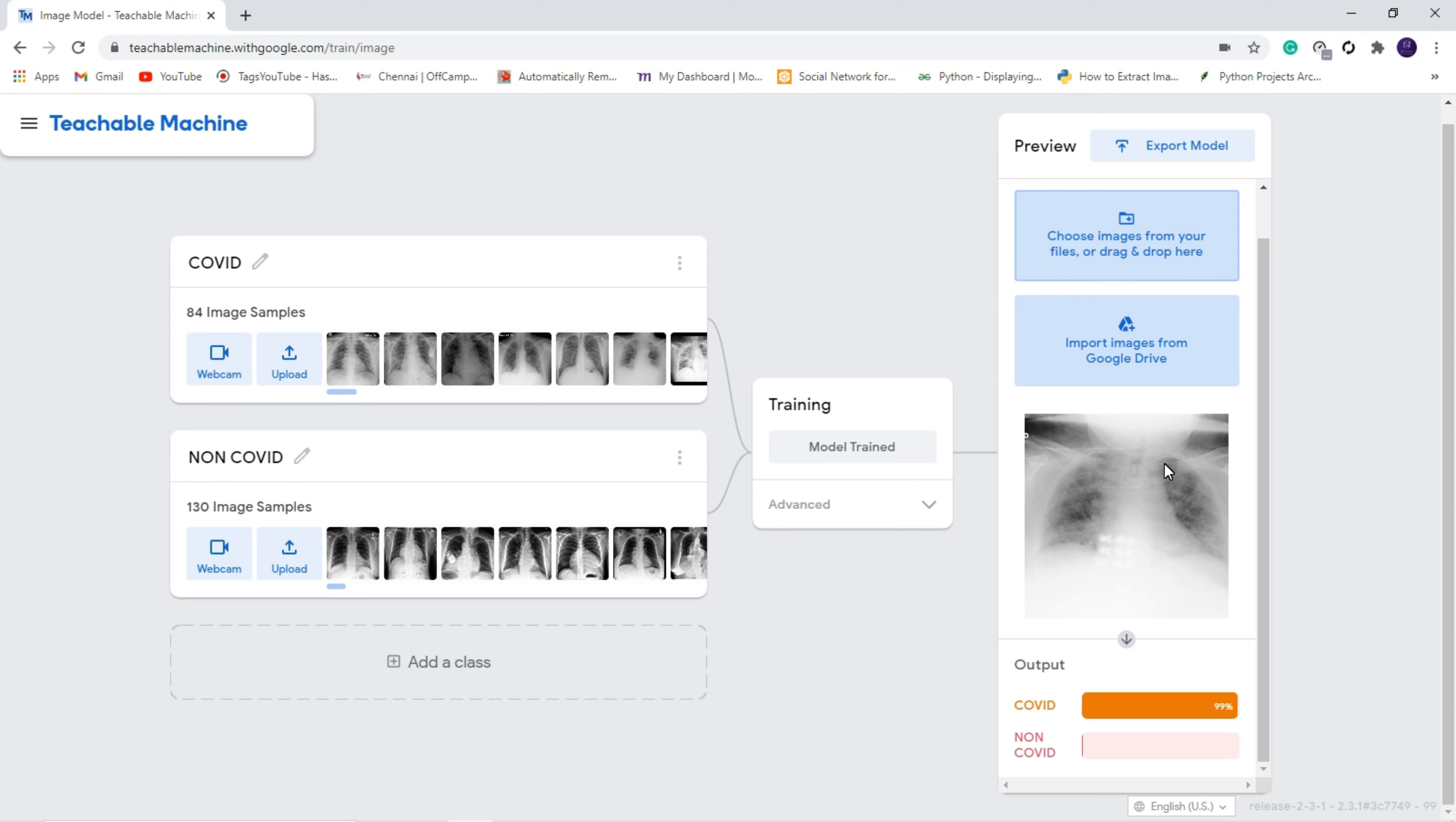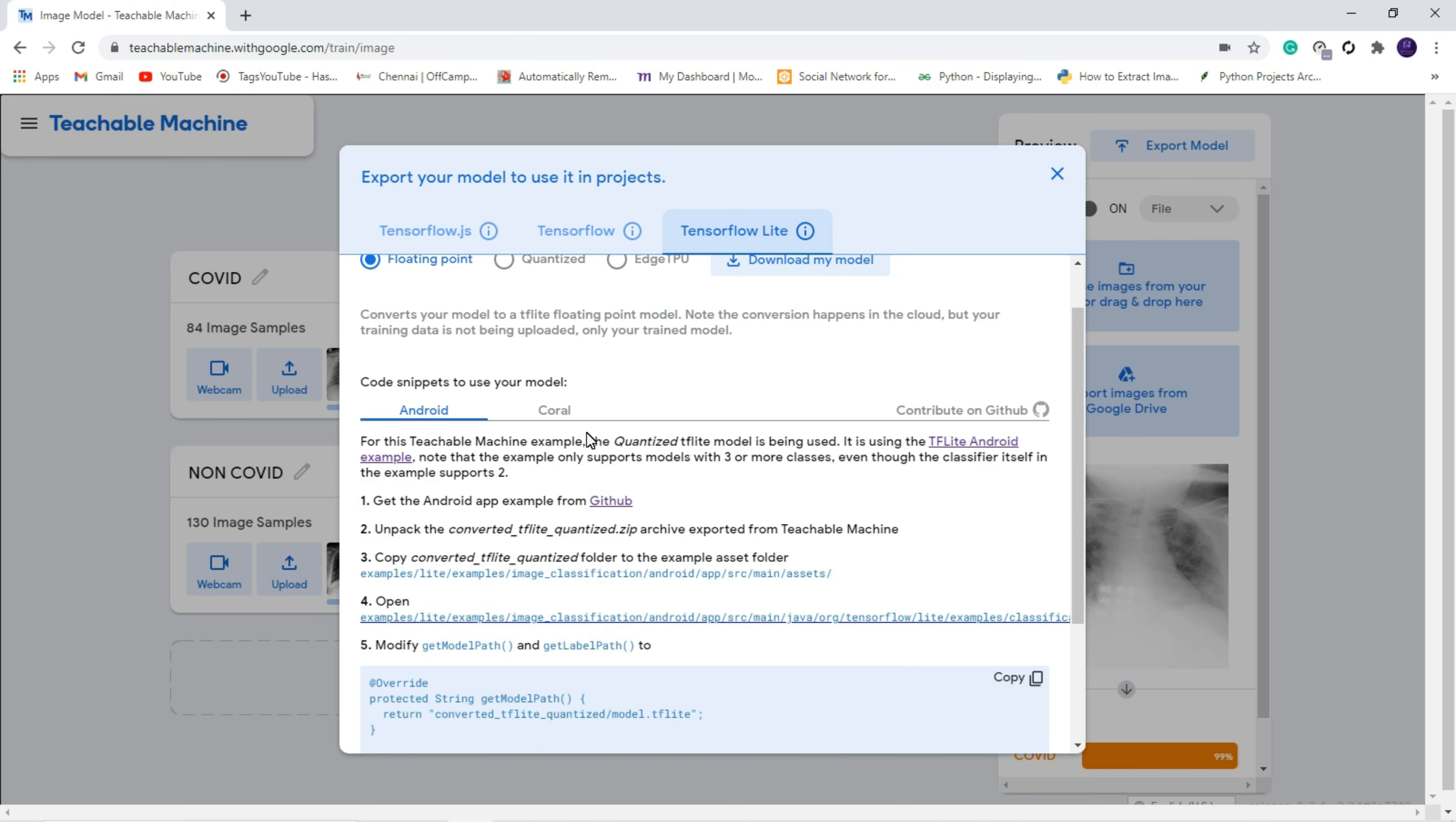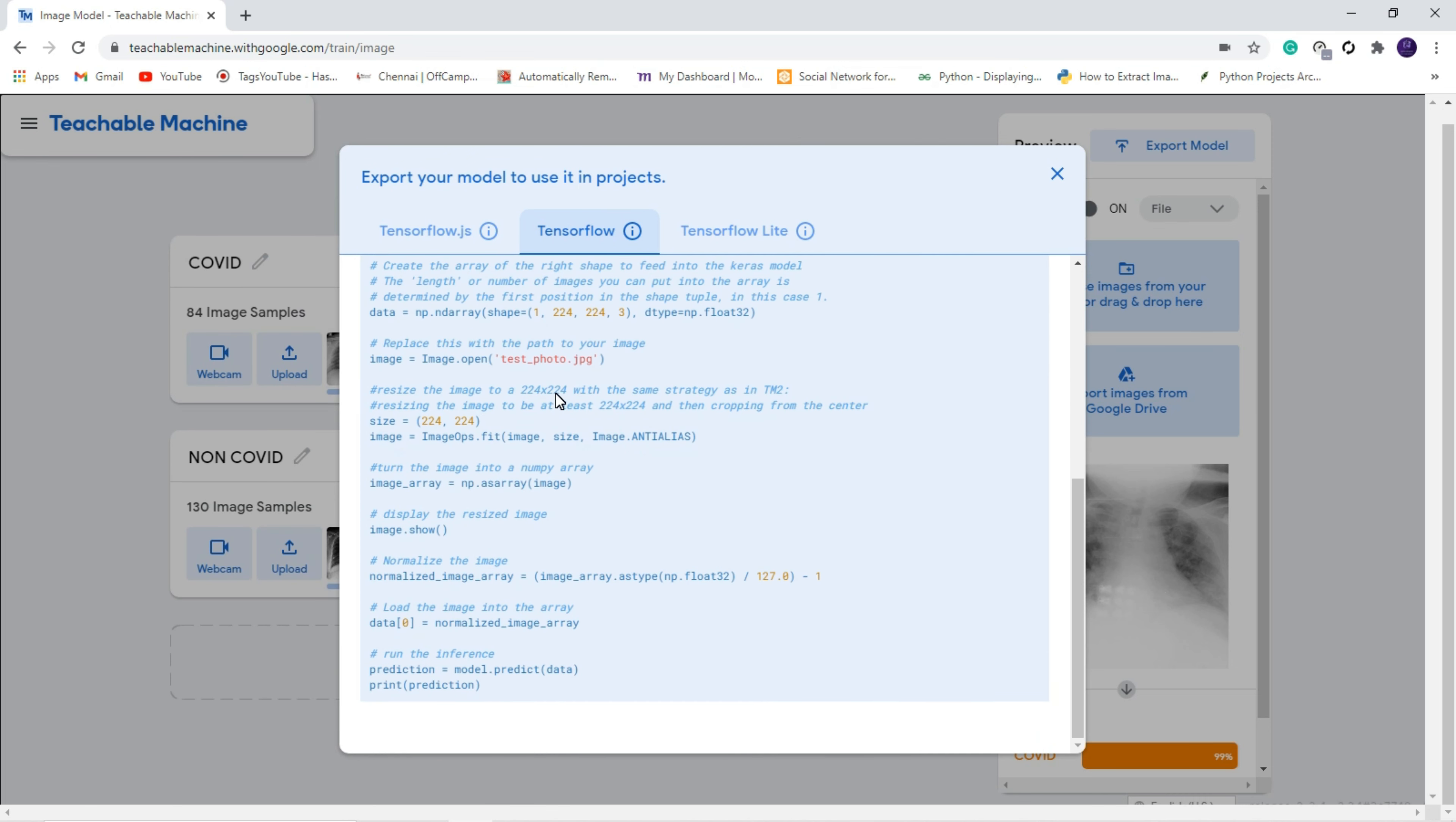This is how we are going to create a machine learning model very easily. If you want source code for this model, you can click export model. Here we have three options. You can get a source code for JavaScript. This is a JavaScript code. If you want code for Python, you can directly get it from here. You can see these are the Python libraries. You can get it from either JavaScript or Python. It's your convenience.